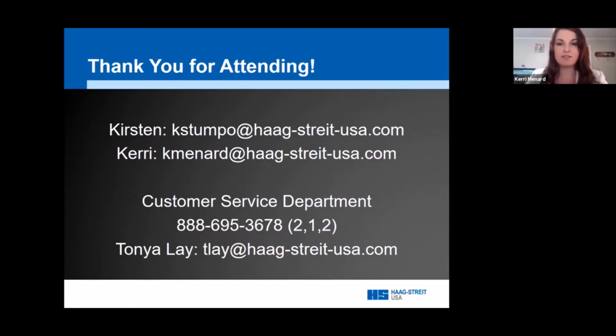And if even one of those is not present, or if your patient blinks, you're going to get a lot of those frowny face emoticons, and it actually provides a lot of confusion to our technicians. So we normally turn those off because they have no relation to the actual quality of the measurements or the data.